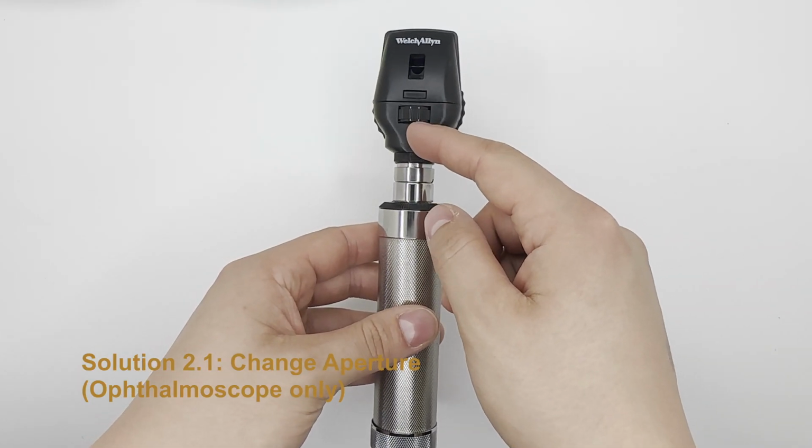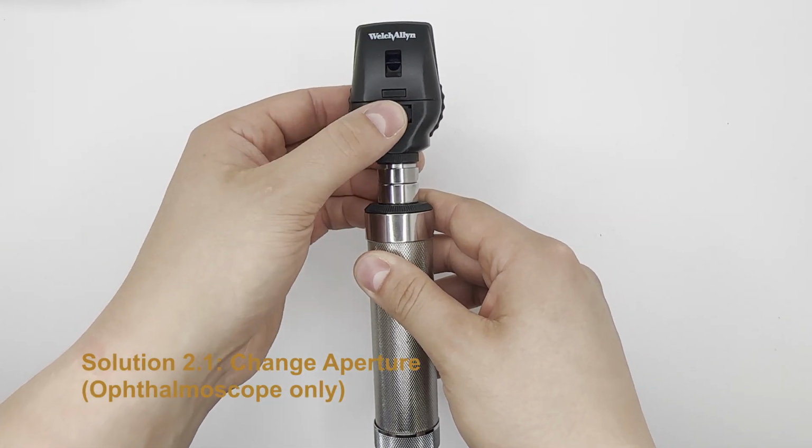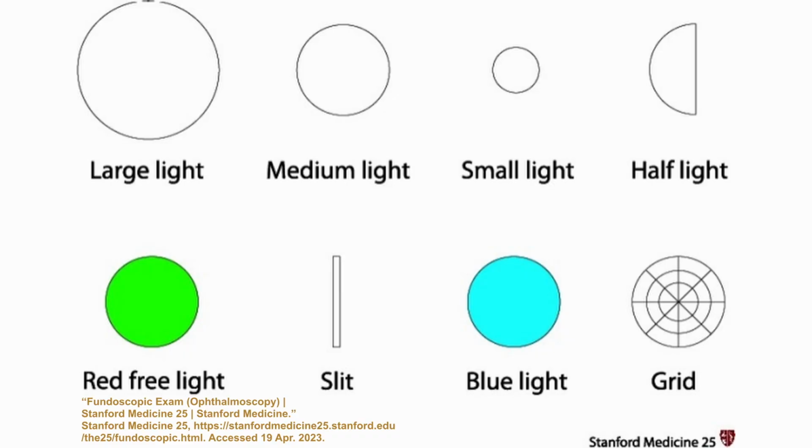Ophthalmoscopes have different settings for different patient pupil conditions and different light conditions. This is controlled by an aperture dial on the front of the head. The large aperture is used for pupils that have been dilated with drops. The medium aperture is used for non-dilated pupils in a dark room. The small aperture is used for constricted pupils in a well-lit room. Check that the aperture setting corresponds to the size of the patient's pupil and the light conditions of the room.